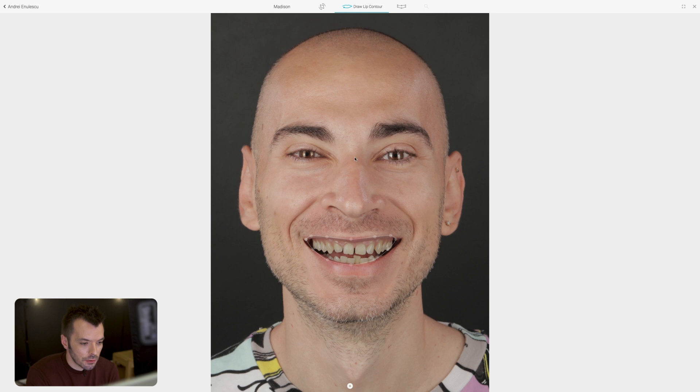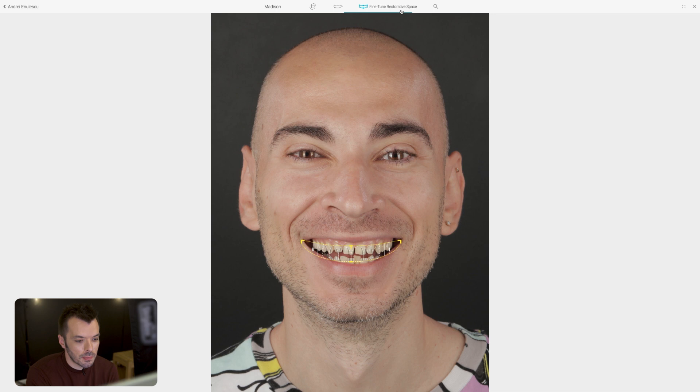The next step is the lip contour, which will again be detected automatically. Feel free to adjust it — just go in and move these dots around to the inner contour of the lip. Nothing fancy; just take your time to do it nicely.